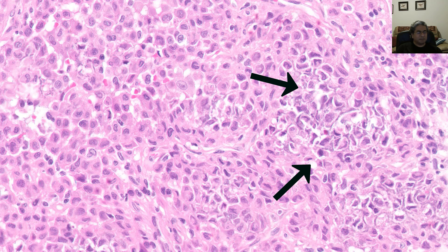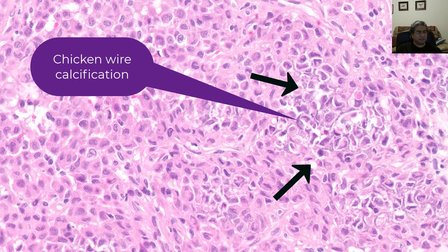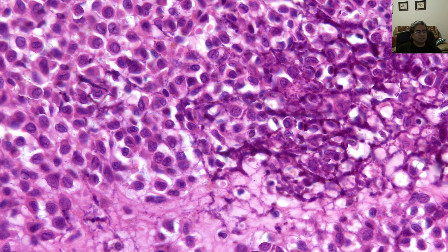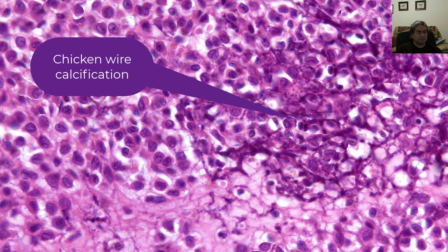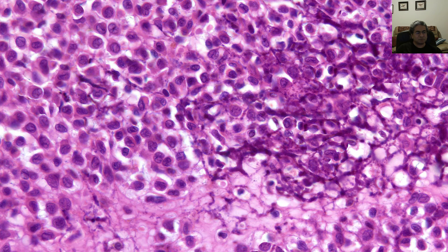Down here there's a bit of calcification — this is the so-called chicken-wire calcification. You may see it, you may not see it. But if you do, you're lucky. If you don't, the cells will give you the answer. And if you're really lucky and you've said your prayers at night, you will see classic chicken-wire calcification: calcification that surrounds the individual neoplastic cells.